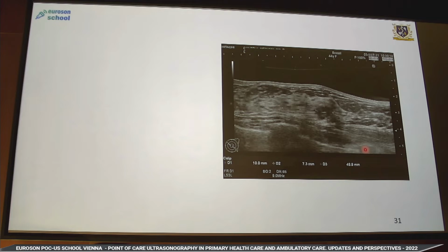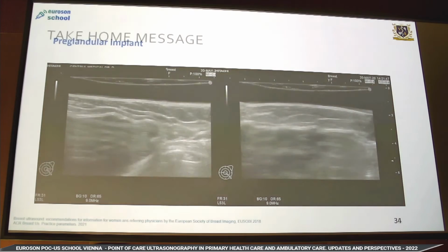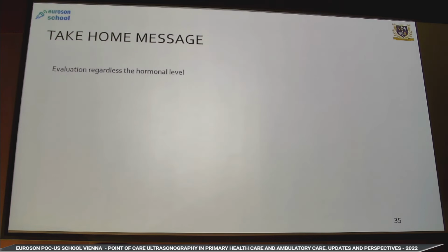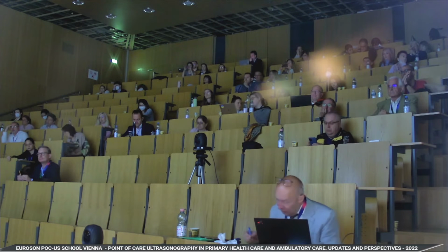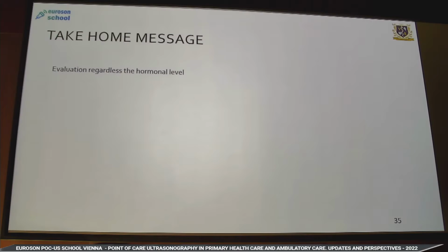Just before my 30 minutes, a take-home message. Evaluation is possible with ultrasound regardless of hormonal level. You don't have to make a break in the supplemental hormonal treatment in postmenopausal women. You don't have to have a special hormonal status or a special day, as you need in mammography and MRI, to perform ultrasound. There are special categories such as pregnancy, lactation, and adolescents, in which ultrasound is preferred.